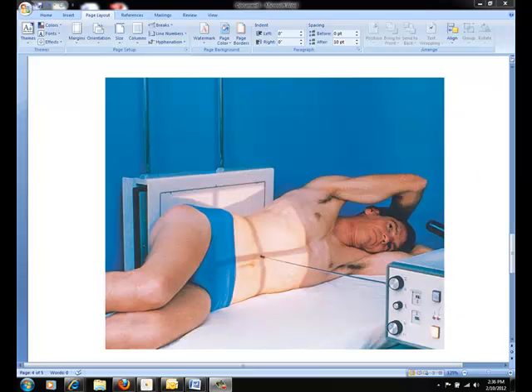If the patient is too weak or ill to stand, you may place him or her in a lateral recumbent position lying on a radiolucent pad or a sponge. Use the left lateral decubitus position for most of these situations. If possible, have the patient lie on the side for several minutes before the exposure. This will allow the air to rise to its highest level within the abdomen.